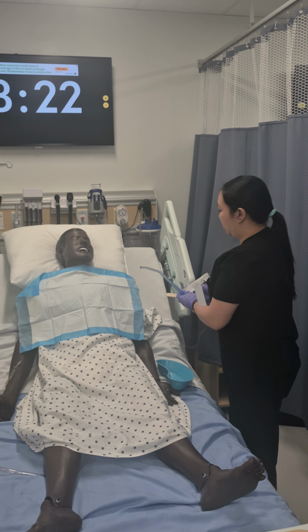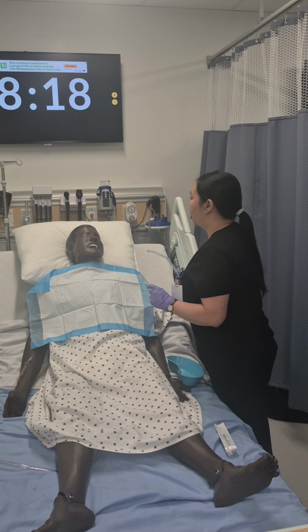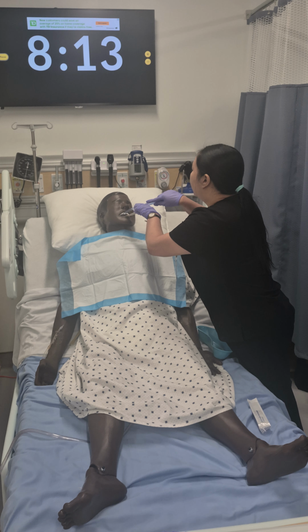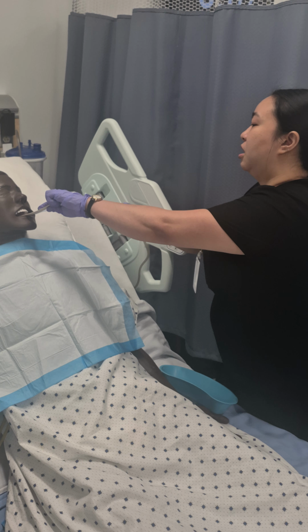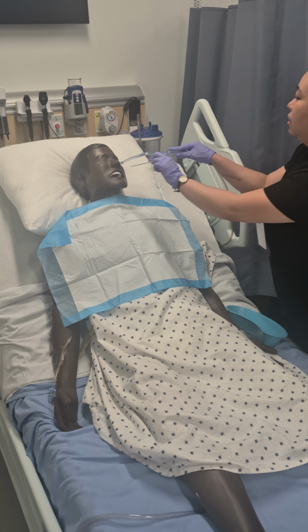I'll do a suction. So Mr. Smith, I will start suctioning because you have an excessive secretion. Just open your mouth. Okay. Then I'm going to go to the side. Just make sure all the secretion is suctioned. Open and then I'm going to do it again one more time.